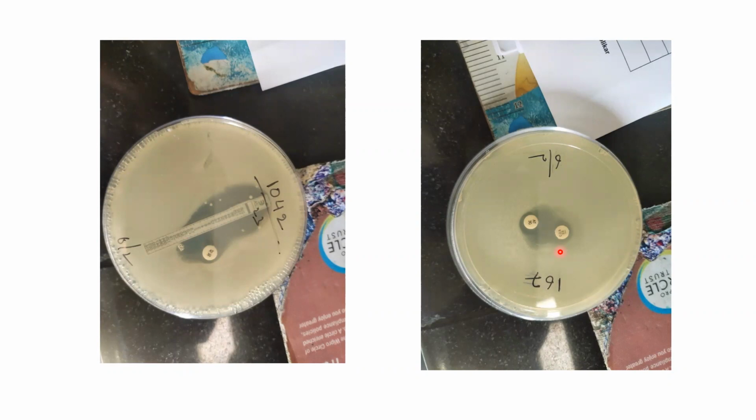See, this is only done in cases where you see a carbapenem resistance. This is not done in all the bacteria, all the organisms. Only when you see a carbapenem resistance, then we do it. But let's say, sir, if I'm dealing with a multi-resistant bacteria in the hospital, can I call up a microbiologist and say, hey, can you run some random combination of two antibiotics and see if there is any synergism? Is that a fair question to ask?